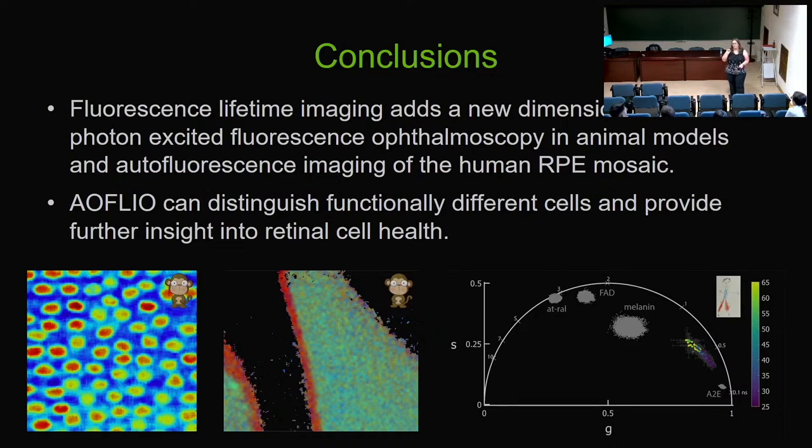So we've been using an 80 megahertz laser in both cases. The phasor plots can be evaluated at the pulse repetition frequency, but they can also be evaluated at other orders of the pulse repetition frequency. So you can evaluate and shift things within phasor space, yes.